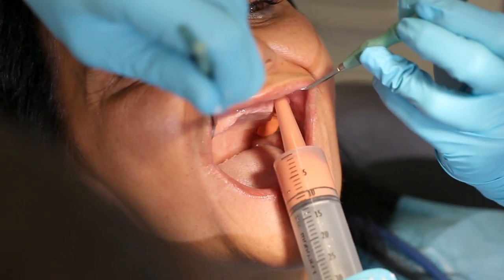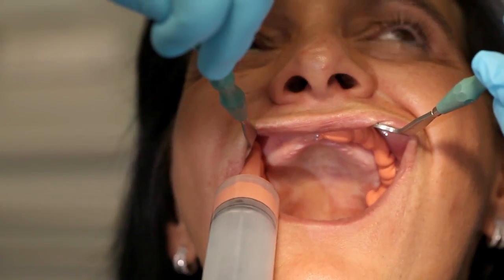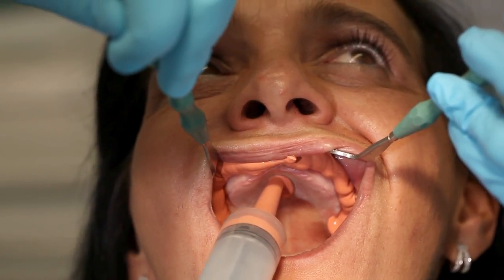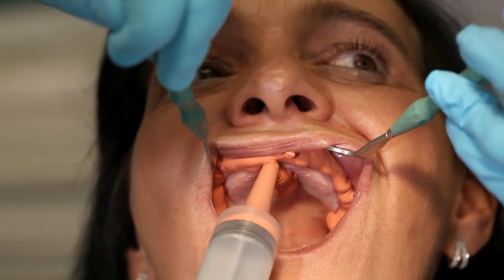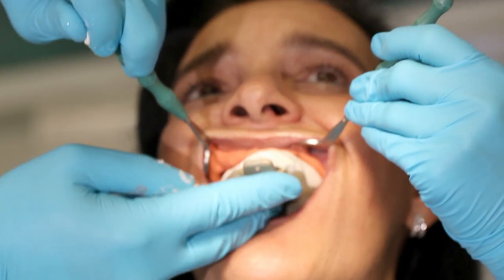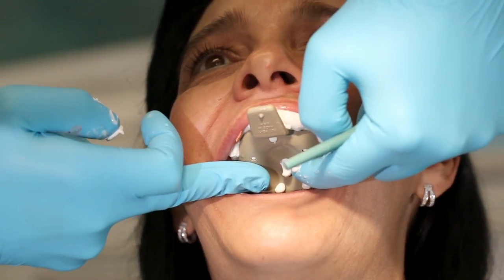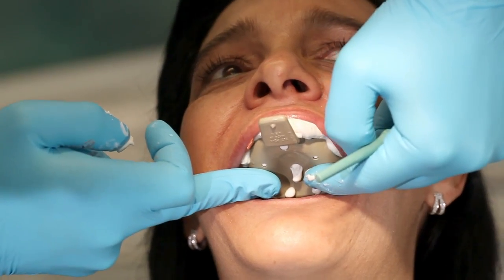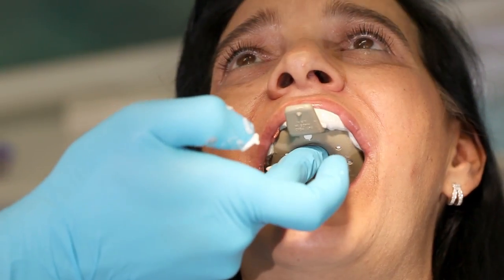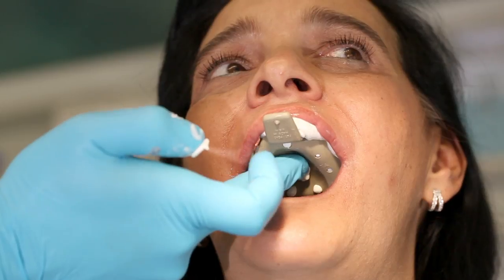Inject the low viscosity material into the mucolabial fold of the upper jaw, starting behind the maxillary tuberosity. Make sure that the lips and cheeks are sufficiently retracted during this working step. Apply the last portion to the anterior palatal area, then rotate the tray into place. First press it into place in the anterior region to keep the lip away, then rotate it slowly upwards towards the posterior region until impression material escapes at the dorsal margin of the tray.